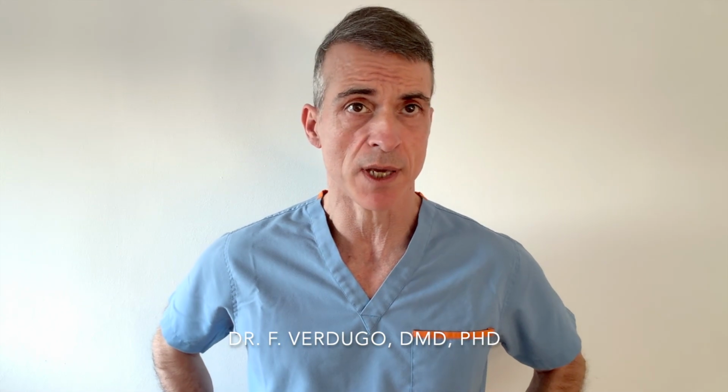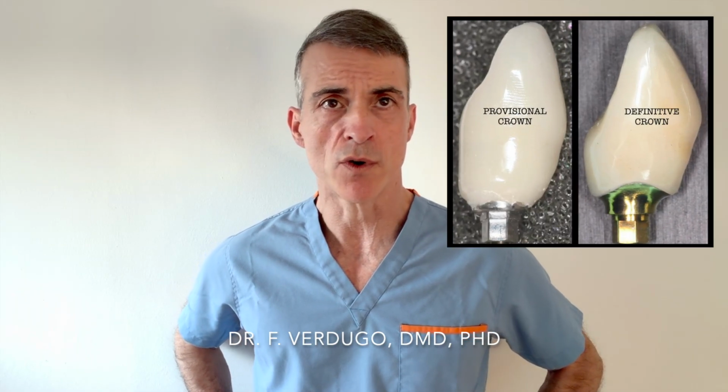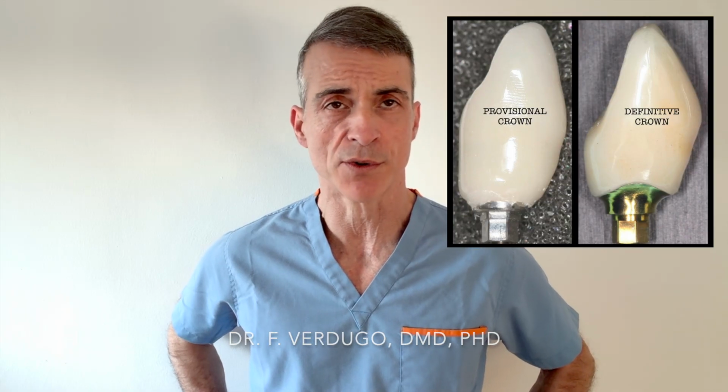We need to consider that sometimes we need to wait for the soft tissues to mature, and we are going to be able to guide them with our provisional restorations during those 3 to 4 months of healing time. So our restorative dentists should bring the patient in for checkups every 2 to 3 weeks to remove or add more resin to the provisional restoration to achieve the ideal aesthetic outcome.